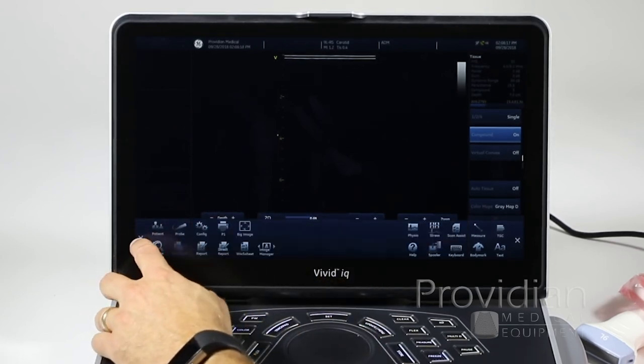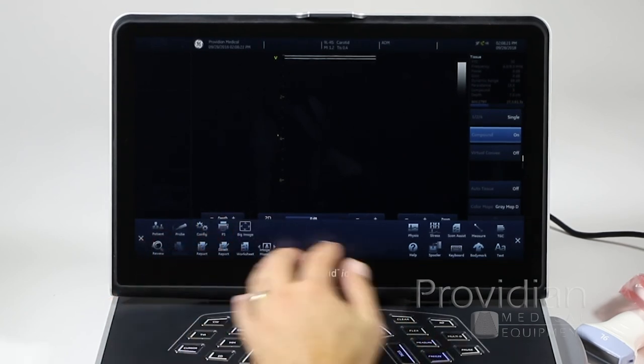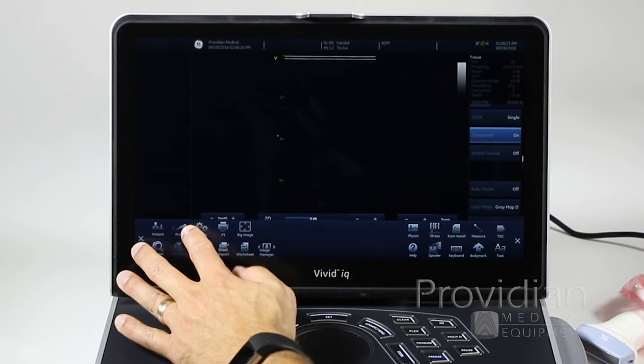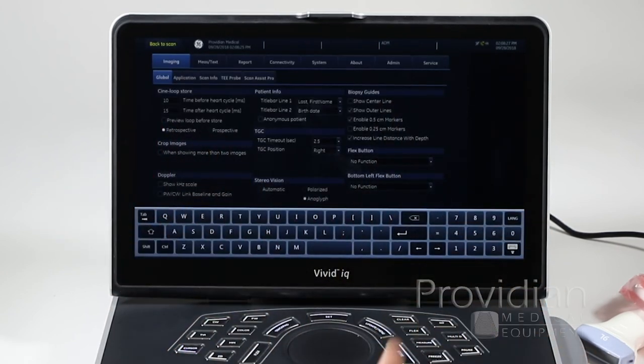We'll get to the probe, review, and other features later. The config button takes you to the system setup, which we'll cover later — but if you're setting up your system and need other information, you can adjust that there.